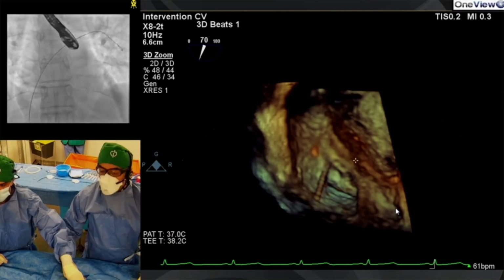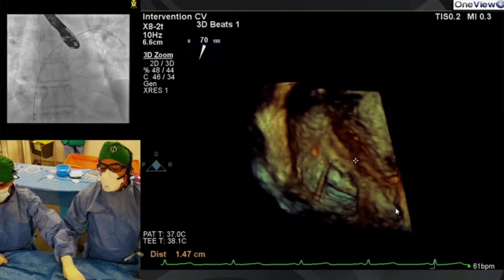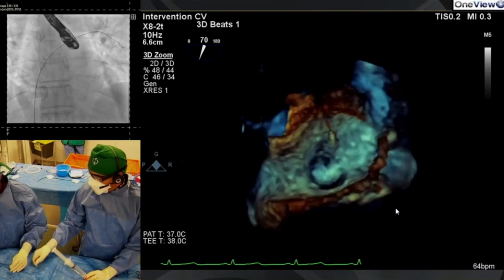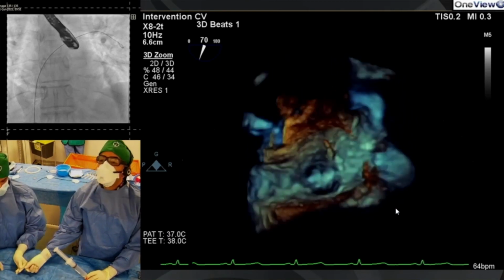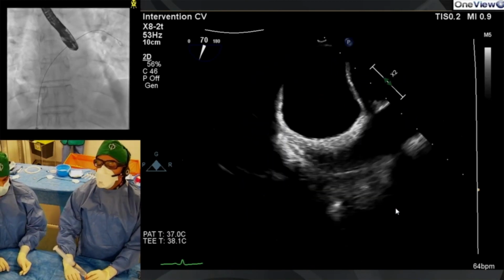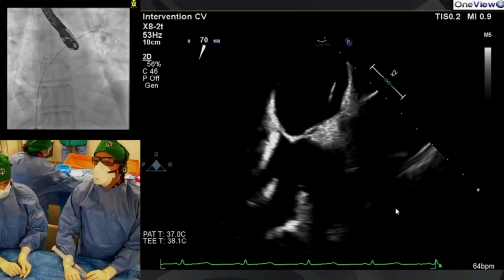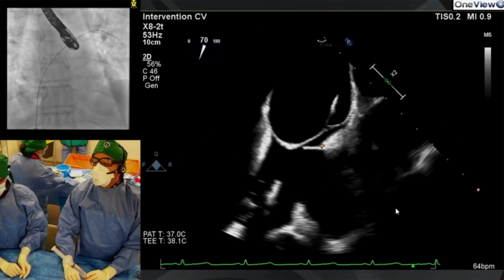I think the only other measurement we haven't seen actually that would be helpful, Bushra, would be just to measure the whole septum. But I mean, a big one would be a 30 millimeter disc on the right, really. I'm not sure there's room in this, but we haven't seen that measurement. There's different sizes of big one, Dave. Well, you can go 35, yeah, but I mean, I'm not sure there's room. It doesn't look to be that big.